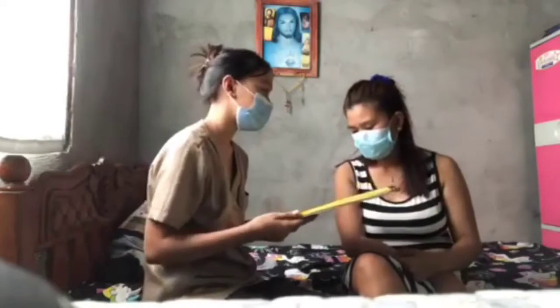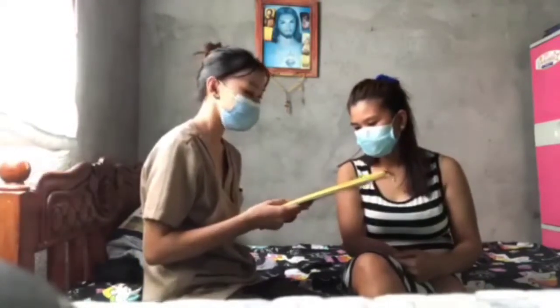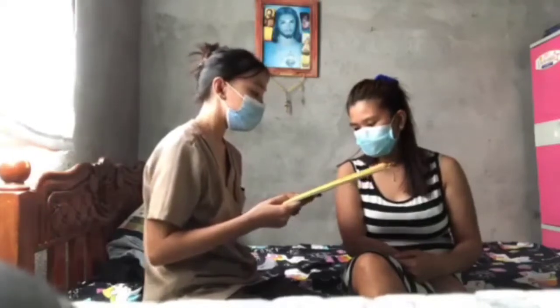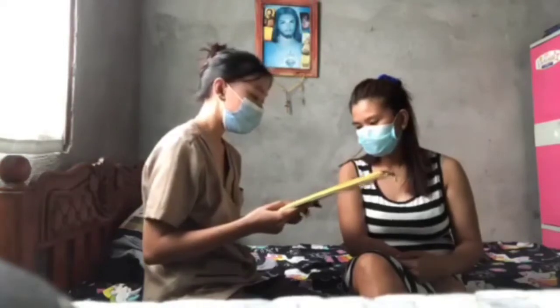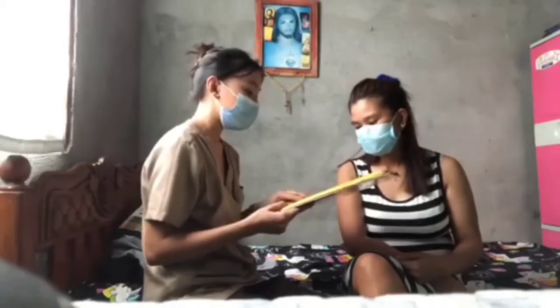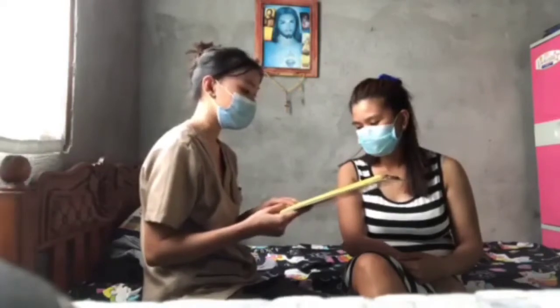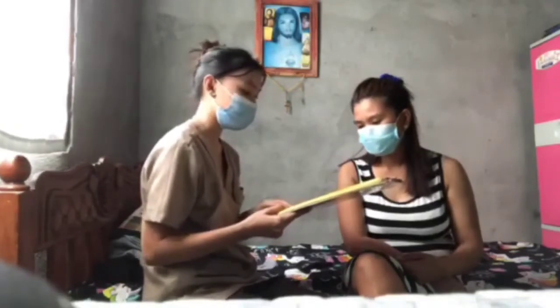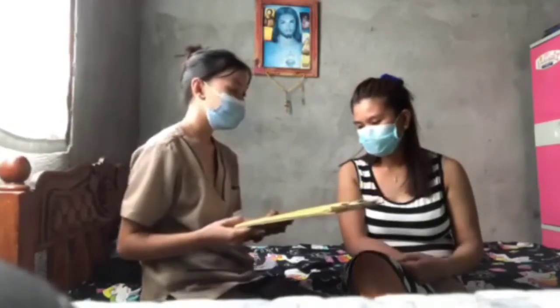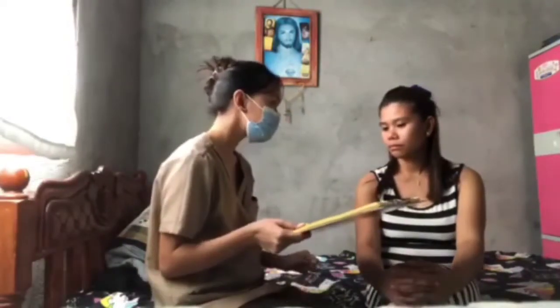Today, Mom, I'll check your oxygen saturation, which allows us to calculate the ratio of oxyhemoglobin in your blood, which is a crucial metric in determining your blood oxygen content and delivery. We will also be able to detect the presence of hypoxemia before any apparent indicator appears as a result of this assessment. Mom, may I ask you if you are allergic to adhesive? No.